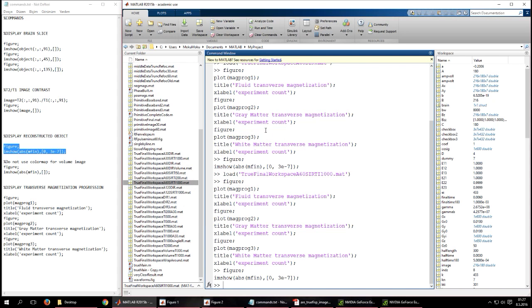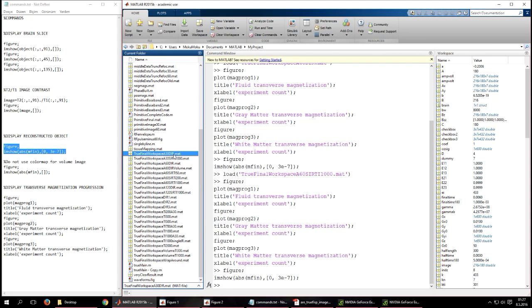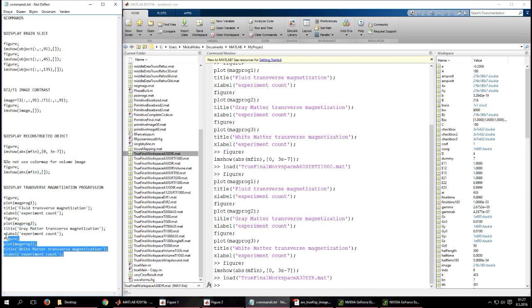The next demonstration is a result of simulation which plus minus 30-degree excitation pulses are used with double inversion recovery applied. Both Ti1 and Ti2 are set to 0.95 seconds. Steady state is achieved very quickly for all three tissues this time.